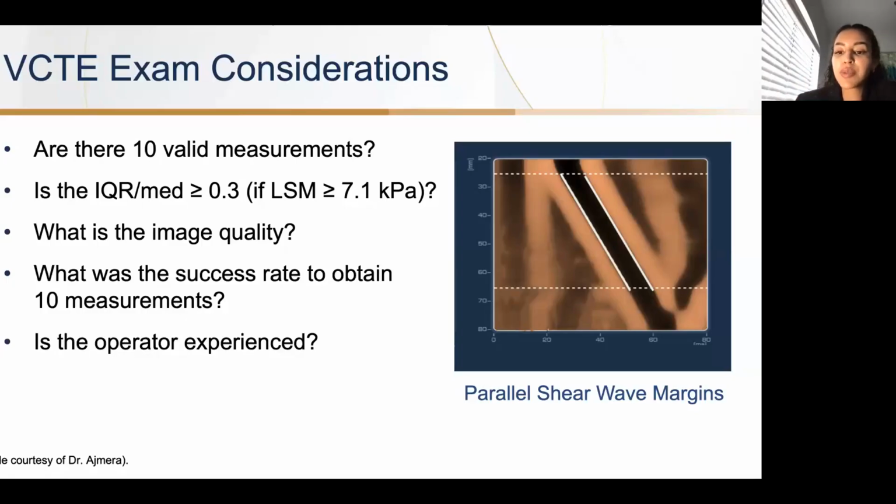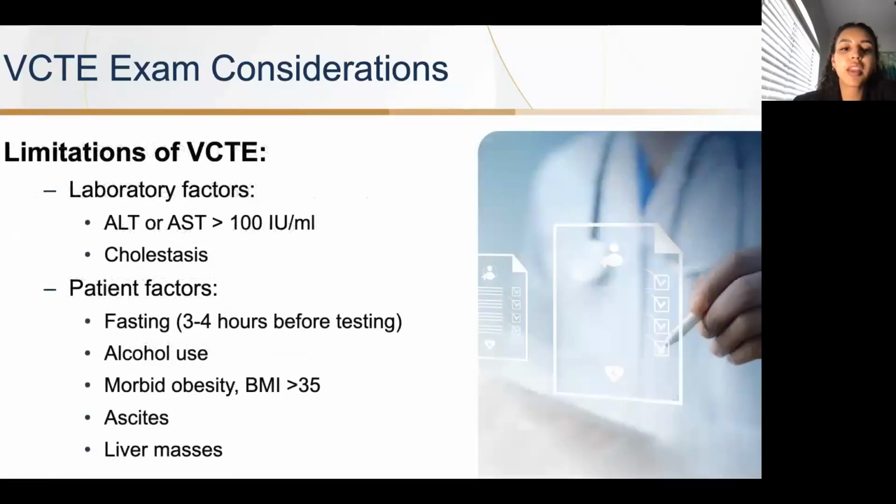And then, is the operator experienced? This is a test that takes a lot of practice. And so our MAs, and several of our providers as well, have gone through an extensive training that's provided by the FibroScan company, and then have a lot of practice before they are cleared to do FibroScans within the clinic. So we want to make sure that our operator is experienced.